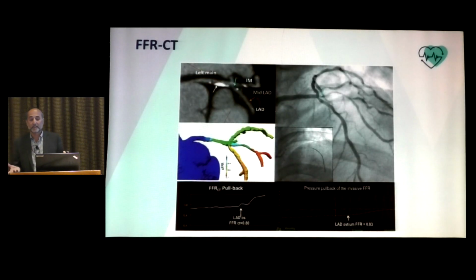Of course, no talk is complete without mentioning FFR CT. This is not the subject of this lecture. I was asked to talk about FFR and iFR, but now we can also assess functional significance of coronary stenosis by doing FFR CT. This is a non-invasive modality. iFR and FFR are invasive. They're done in the cath lab, but you can do an assessment of stenotic severity non-invasively.